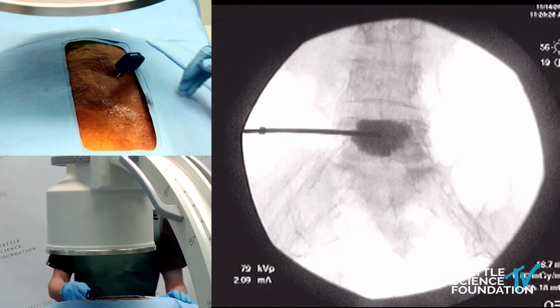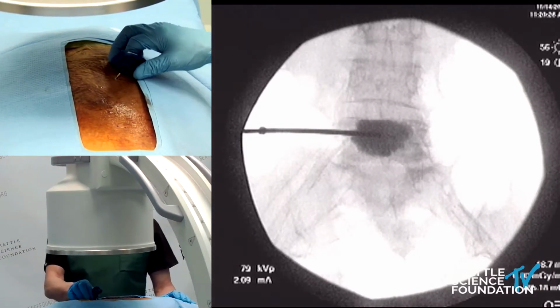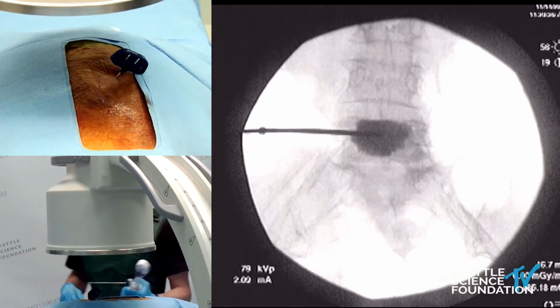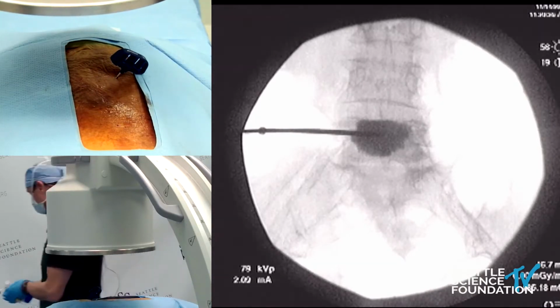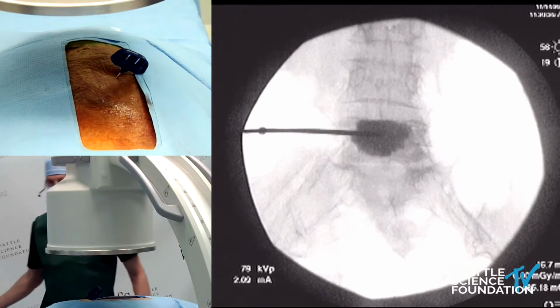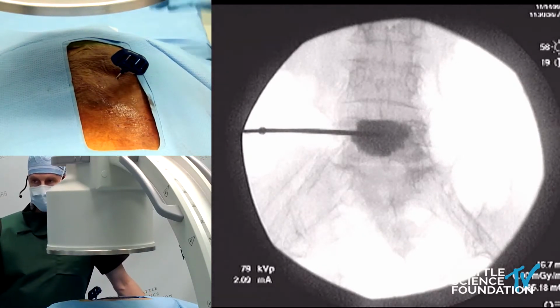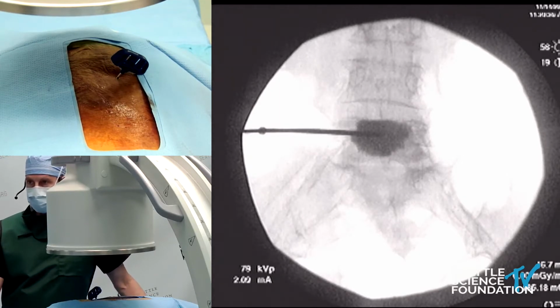All right, once you leave this in and then pull it out, and this is, again, the Arcadia balloon from Merit. And this has just been released. These are brand new tools. They've just been released this year, so I've used it a number of different times, and this is a very predictable result. This is not unusual at all. So, well done.